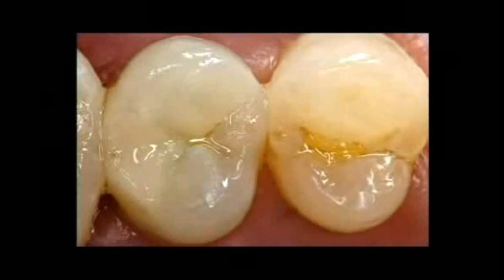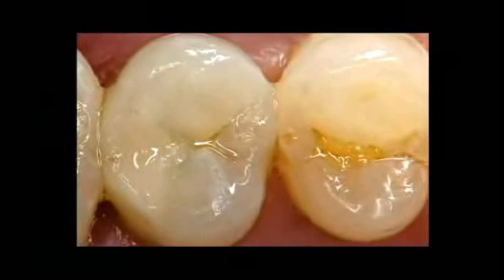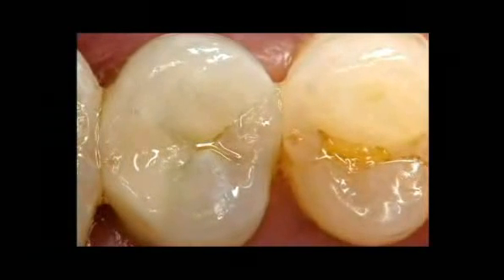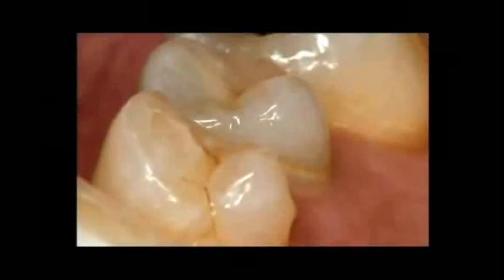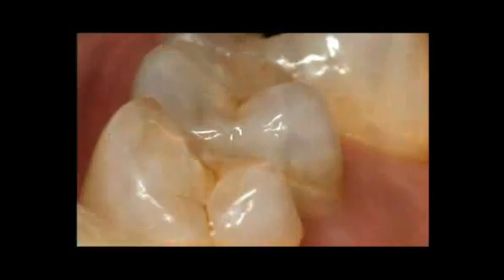The completed bioactive restoration allows for a more conservative preparation, which is capable of arresting and eliminating the carious process. Notice the harmonious integration of this improved glass ionomer system with tooth structure. The radiopacity of this material provides contrast with tooth structure sufficient to allow future monitoring of the restoration.